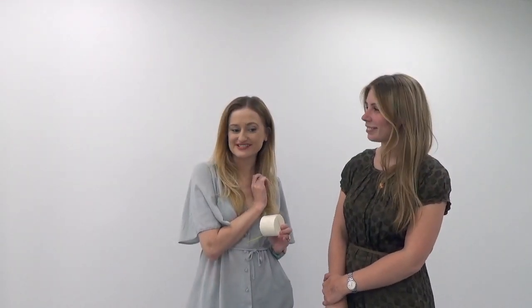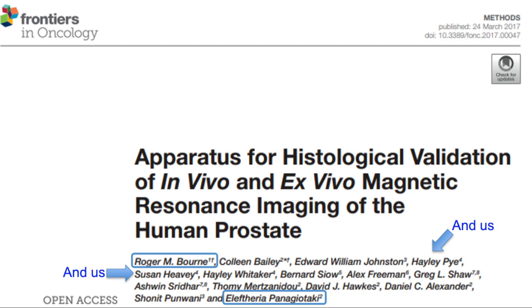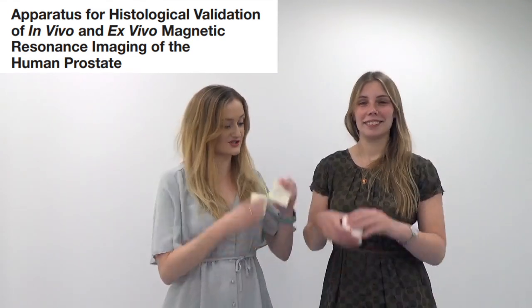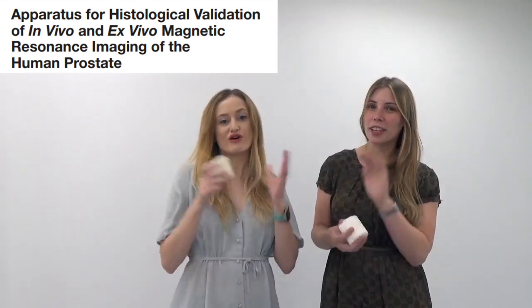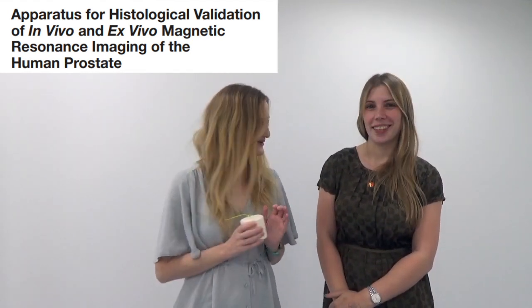We've already had a couple of publications out from the wider research group about this, and hopefully a lot more to come. Paper number one - I'll have the title flash up on screen now - is called 'Apparatus for histological validation of in vivo and ex vivo magnetic resonance imaging of the human prostate.' When we say 'apparatus' we're actually talking about this 3D printed mold, as well as a 3D printed blade handle for cutting, containers, and everything - all made from scratch by Roger. Beautiful 3D printing magic.